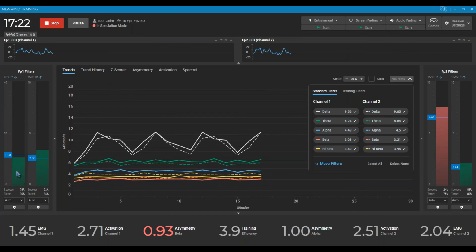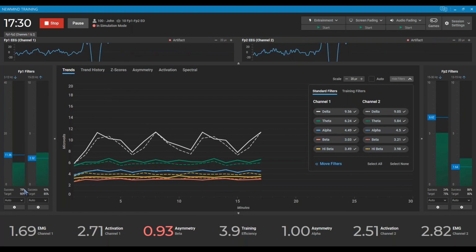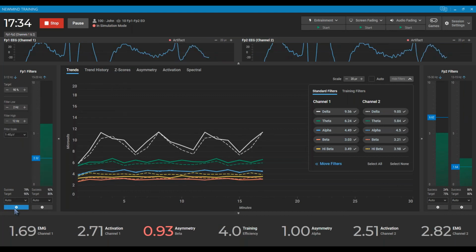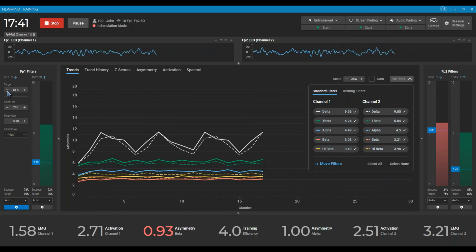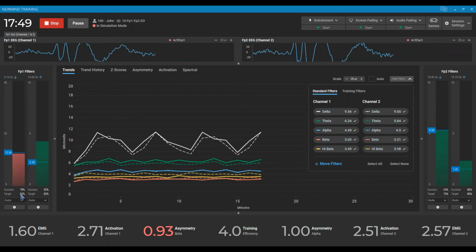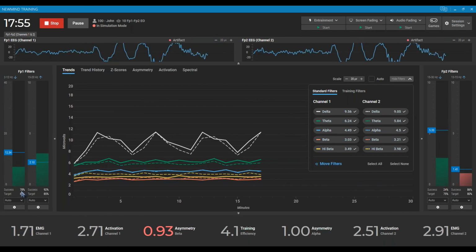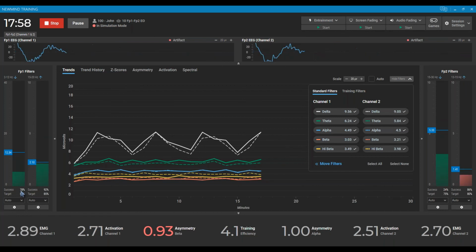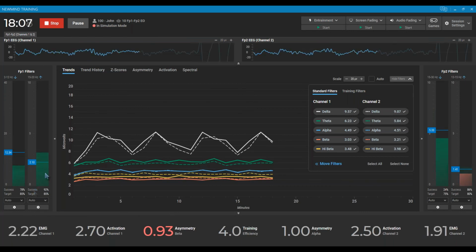So you adjust your target percentage in the filter options here. It's all the way at the top. You'll see there's the 90%, so I can back that down. There's Rob's starting point at 85. Then you can watch as you set that target percentage over the next couple minutes what happens to their success percentage. Again, you want to keep it up fairly high. You want to give them the opportunity to succeed. And there we can see it just moved up to 88%. That's a good percentage right there.